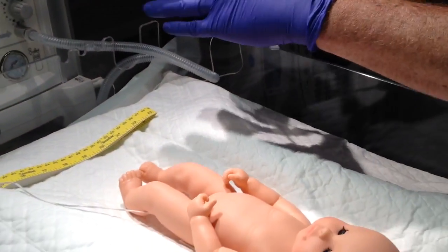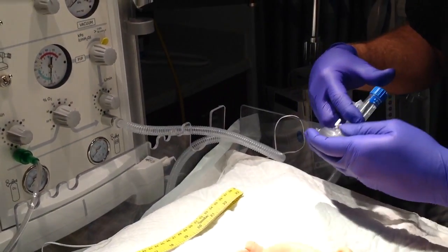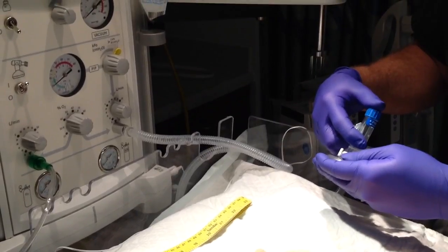Always pressure check your circuit. Put your hand over the end, adjust your pressure to where you want it, and make sure your PEEP is around 4.